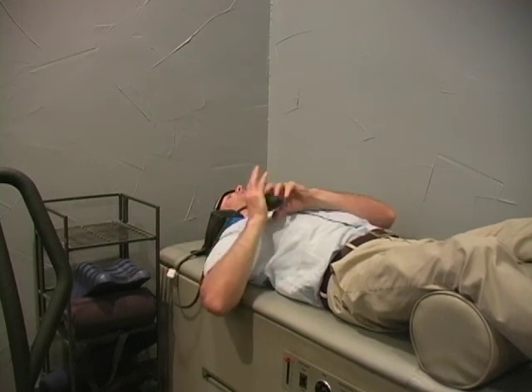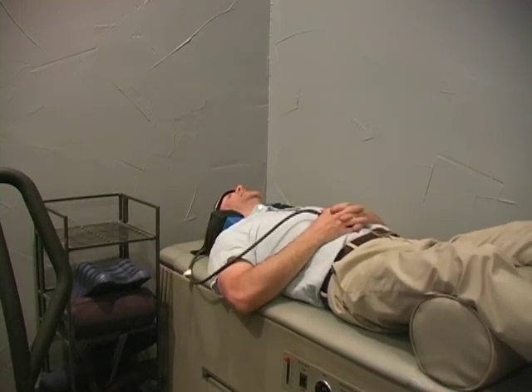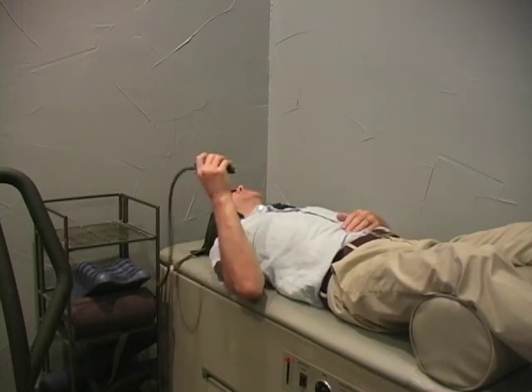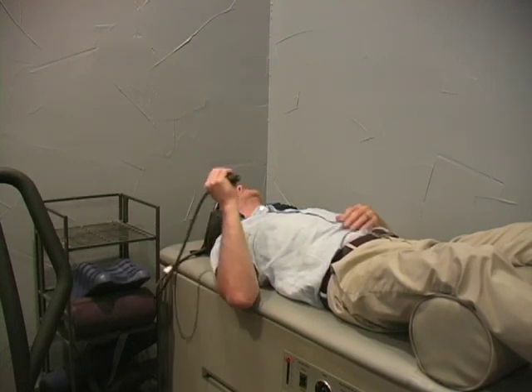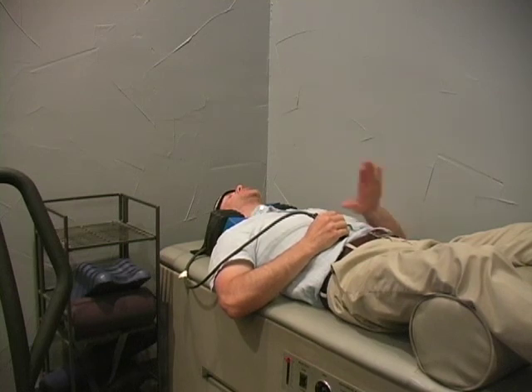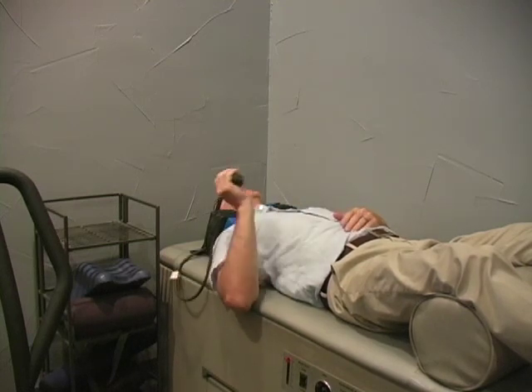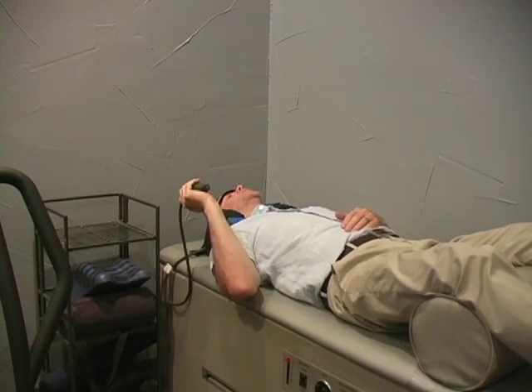You get the benefit of the lifting of the natural lordotic arch of the neck. Just being in the device is therapeutic, even if you didn't pump it. But when you pump the device, it gives you just a real subtle amount of traction and separation, which really helps shape and train the natural arch, the curve of the neck called the lordosis.